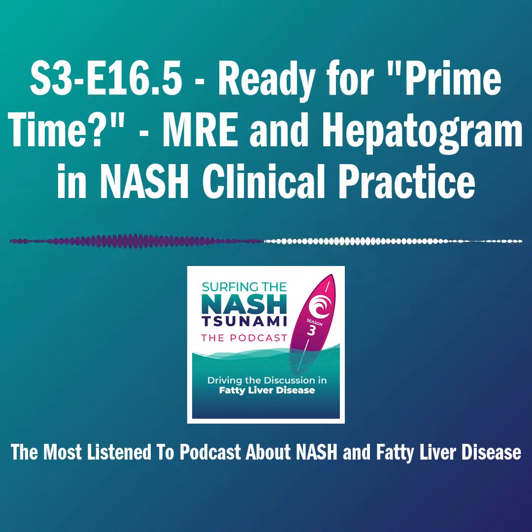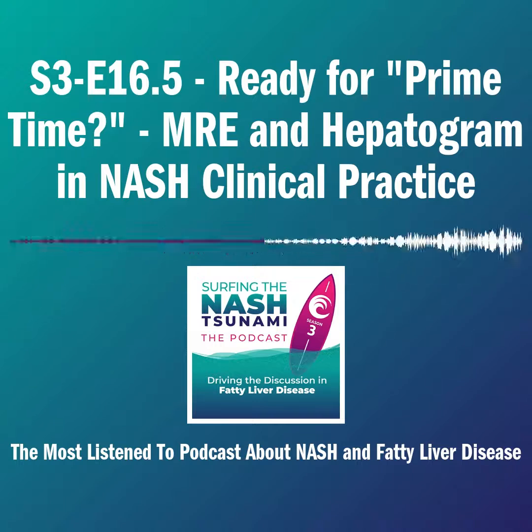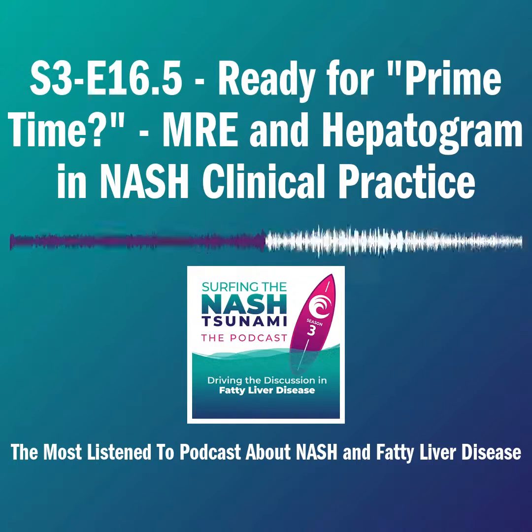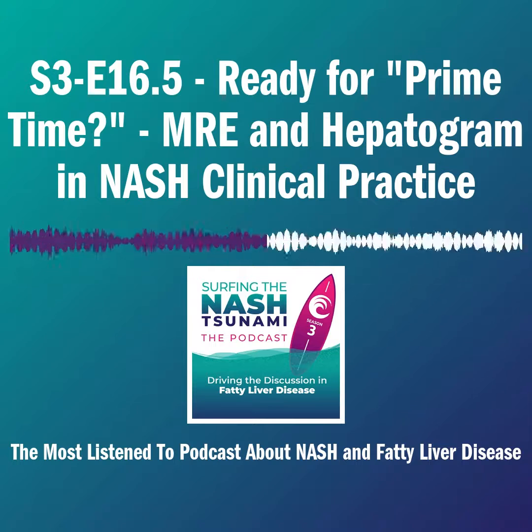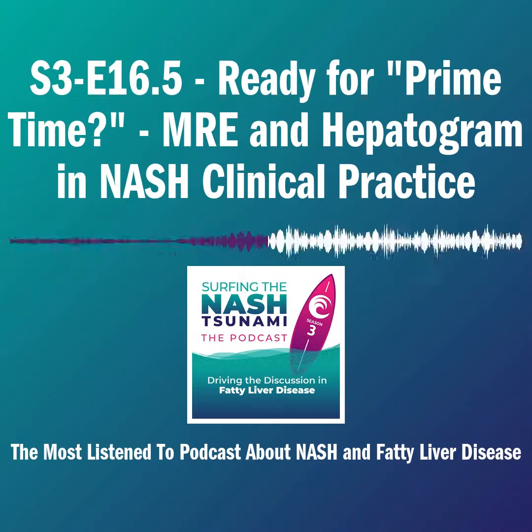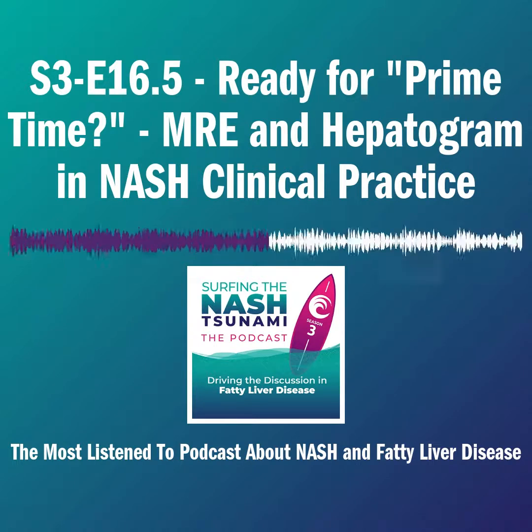And what I know about MR elastography is that we're really good at identifying when MRE is worsening, that's linking to worsening of underlying liver disease. And we talk about 15%, maybe 20% worsening of MR elastography. And I think that gets us over the coefficient of variance of MR elastography and predicting that outcome. But what I would like to ask you is, do we have any clear data on improving MRE and what threshold we have to do to link to improvement in underlying NASH or fibrosis?